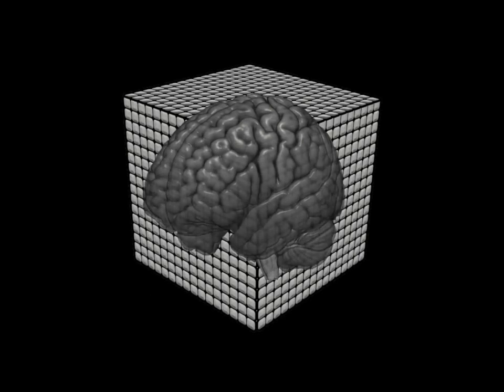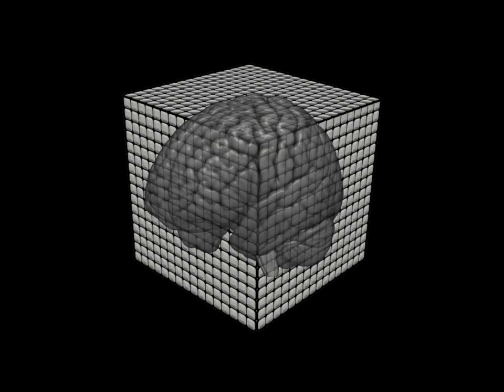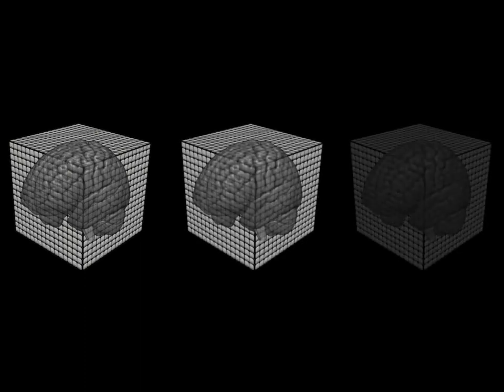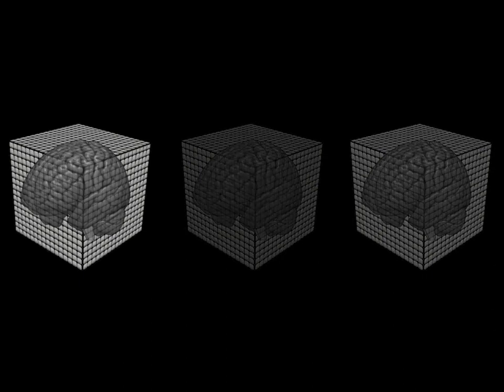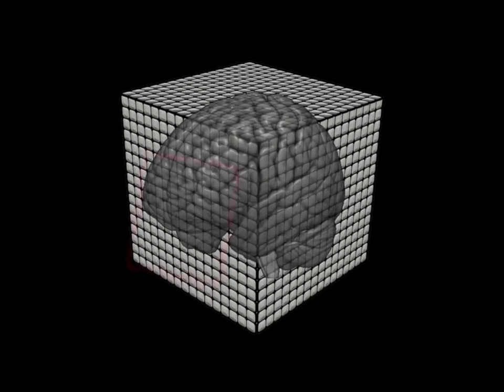Now, just to illustrate conceptually what this data looks like, because it's not immediately intuitive just looking at it on the command line or the GUI. I like to think of each volume as like a big Rubik's Cube, right? We image the entire brain, but each smaller cube is something called a voxel. That's the smallest spatial resolution element that we have, and we get signal from each of those. So we take an entire snapshot of the brain, time point 1, another snapshot, time point 2, another snapshot, time point 3, and with the functional data set, we're just daisy chaining all of these different volumes together. So we have 3 dimensions and then a time dimension in the 4th dimension.